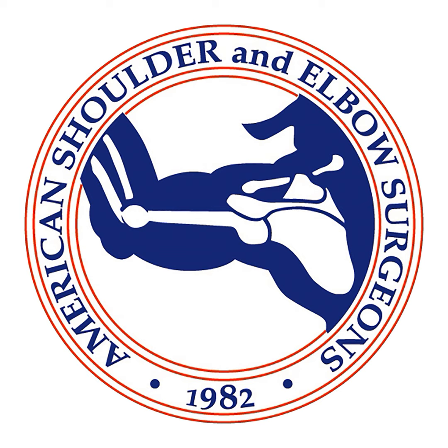I think you think of disadvantages. I'll just share with you, I remember when stemless first came out, what we were seeing, at least at Mayo Clinic, in the patients that I saw, was not the problems associated with implant loosening. It was almost exclusively cuff failure. Interesting. And I think I started understanding it when I started doing more stemless myself.